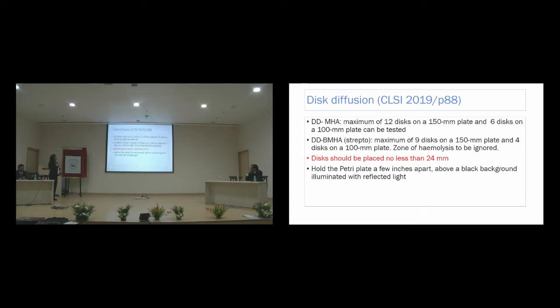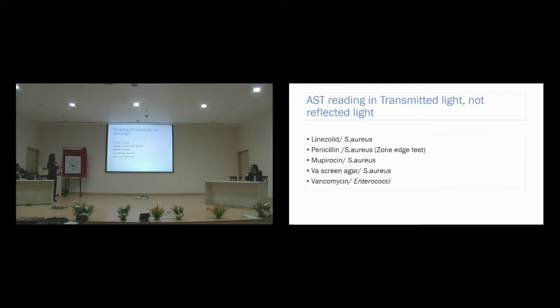Then hold the Petri plate a few inches above a black background with reflected light. This is the general note we see in the CLSI guideline, but there are exceptions where transmitted light is used and not reflected light. In general, most of the time it is reflected light that is used for taking the reading, except in these situations where we use transmitted light.